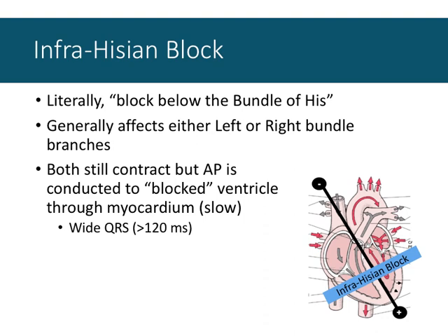It has to arrive from somewhere else. And so we circumvent the broken bundle branch, the broken electrical pathway, by sending that signal through the heart tissue. So we have automatically a wide QRS complex. Whether the block is in the right or the left bundle branch, or both, the QRS complex is wider than normal.